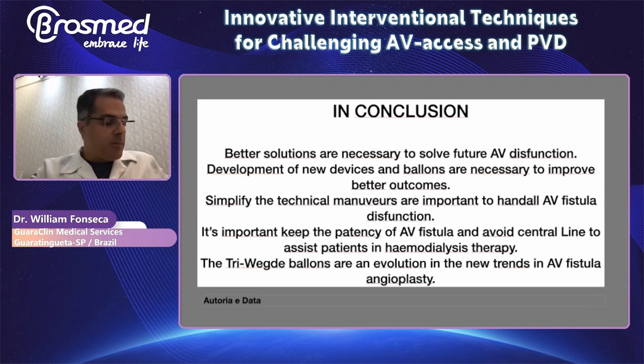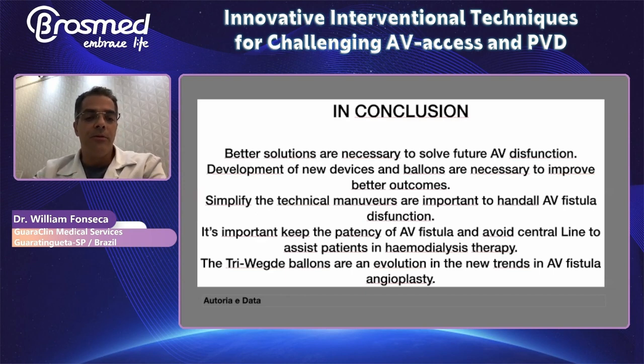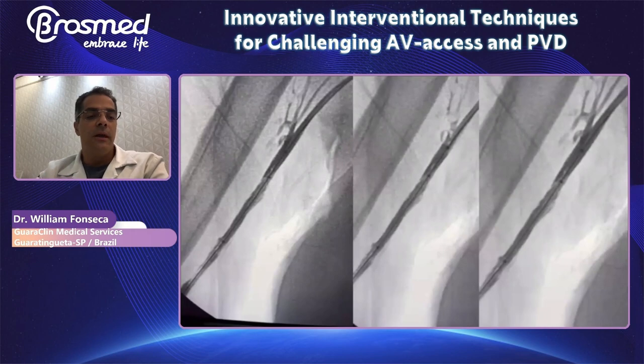I don't want to extend the discussion, but sometimes we want to have answers. We know that we need more data to face this type of lesion, because I have an initial experience with Tri-wedge balloons. In my practice nowadays, I use drug-eluting balloons at the end of the procedure in all cases as possible. And I prefer to use the Tri-wedge balloon at the beginning to avoid this type of lesion, to avoid the bad results, and to offer better results for the patient.